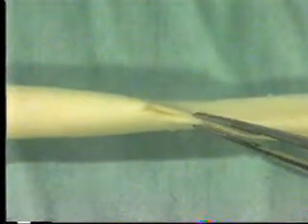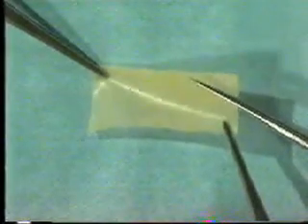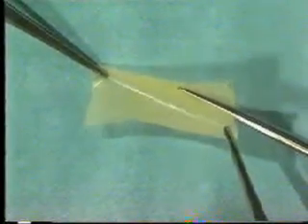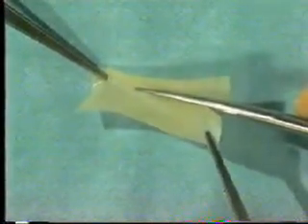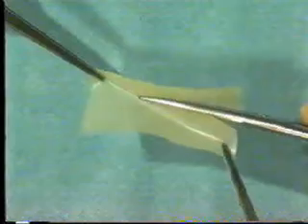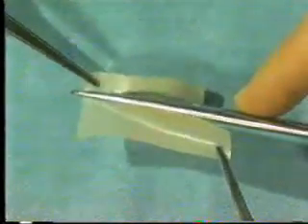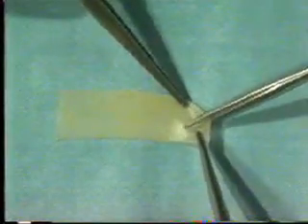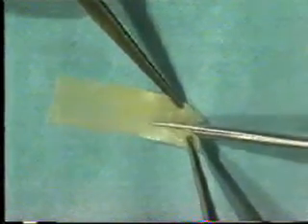Using the simulated vein provided, cut one end in the form of an ellipse, but leave the other end of the patch long and unshaped at this stage. This section of the patch can thus be grasped without risk of damage to that portion of the intima which will subsequently be in contact with the blood.